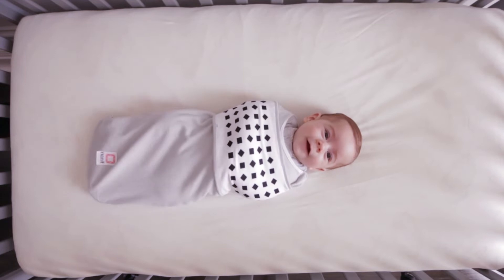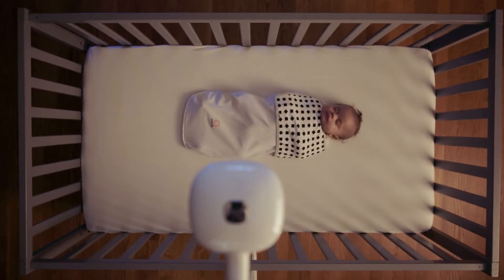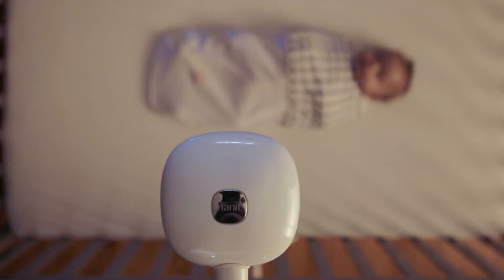Nanit Breathing Wear was created to monitor your baby's breathing motion through the Nanit Plus camera after you leave them in their crib. The advanced sensors in the camera can see your baby's breathing motion down to the pixel level, simply by reading the patterns on the breathing wear fabric, in light or in dark.